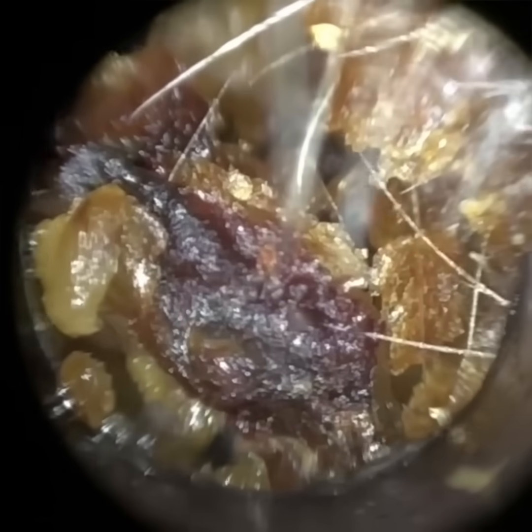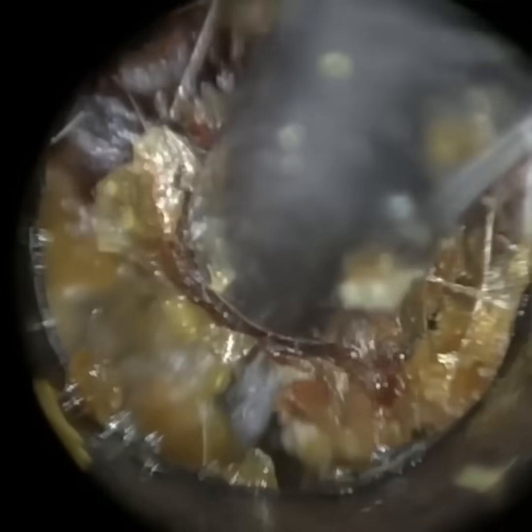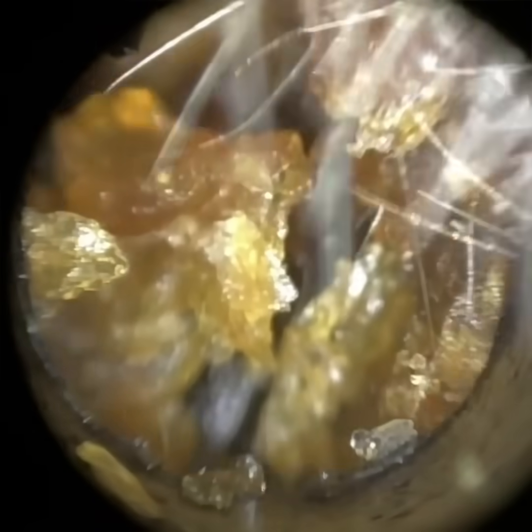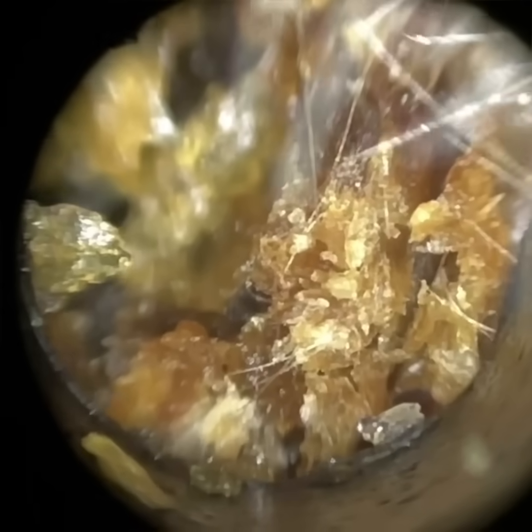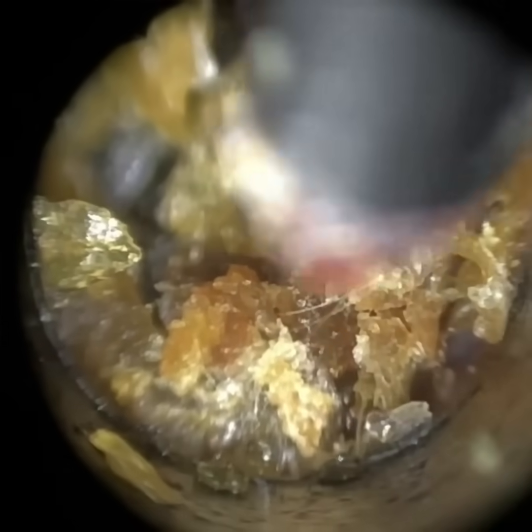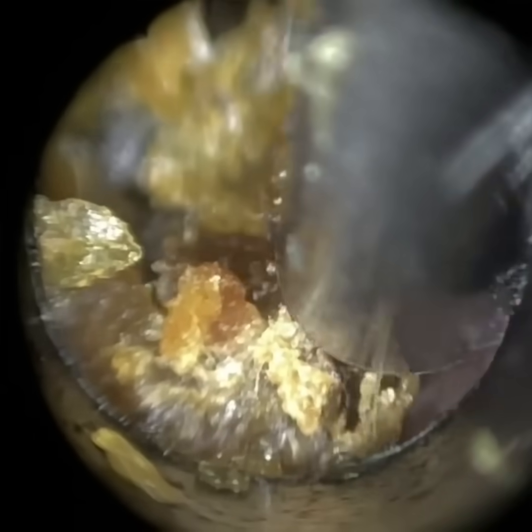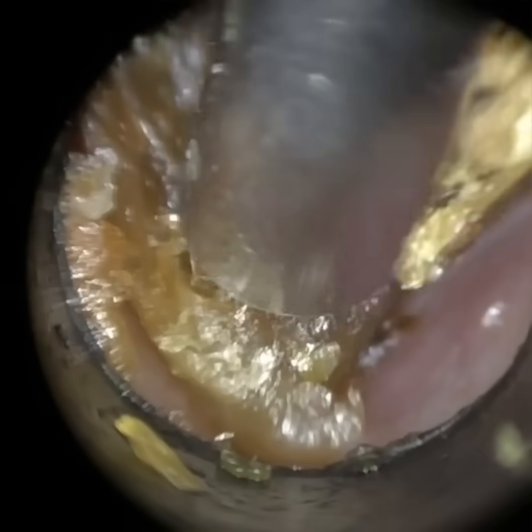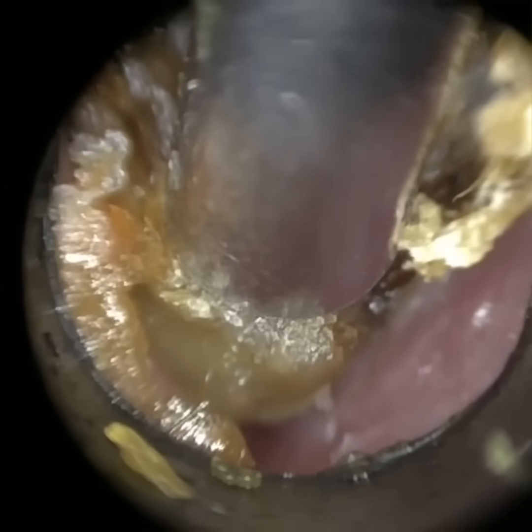So you can see with the WAXscope, the view you get, it's a very magnified view, detailed view. But of course, the WAXscope is a lot more narrowed. It's not an endoscope. So with an endoscope, the lens is inside the ear, hence the term endoscope. And you can't compete really with the view provided by an endoscope. But as I've mentioned earlier and in previous videos, an endoscope is a difficult instrument for many people to use. It does require high skill level. So an endoscope, therefore, is no good to someone who's not able to use it.